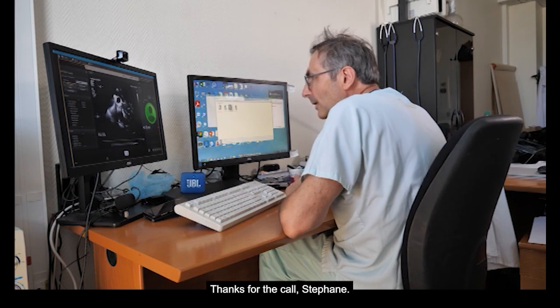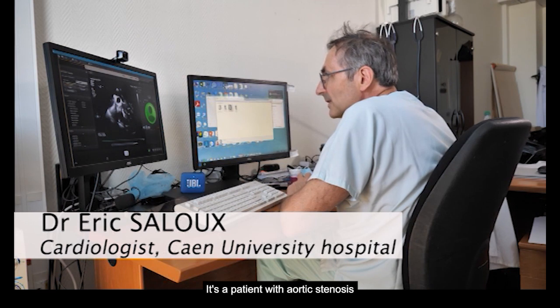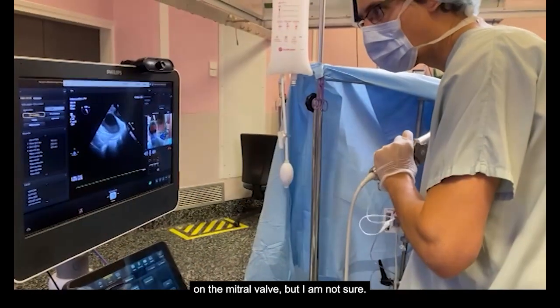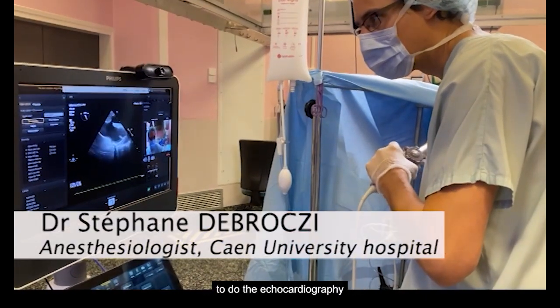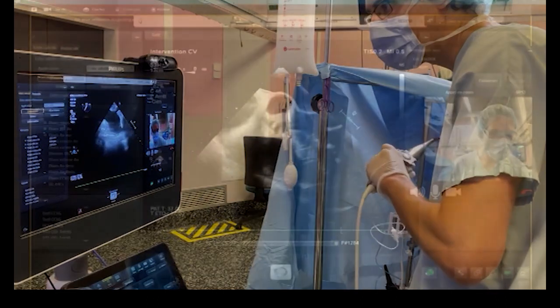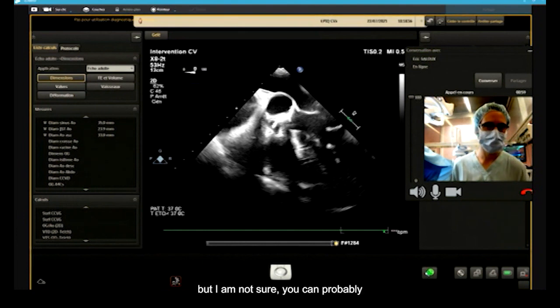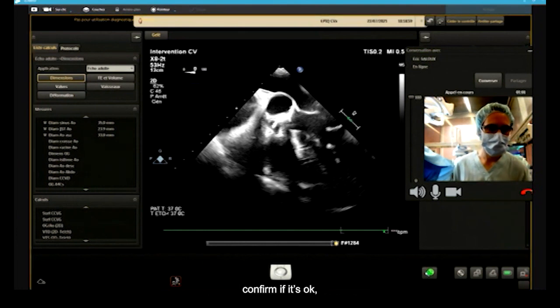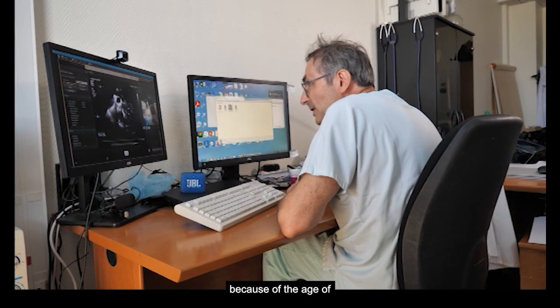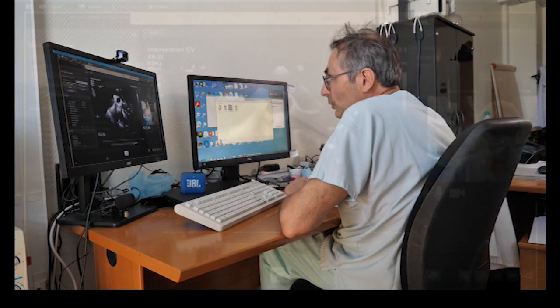Thanks for the call, Stefan. You are with a patient I saw yesterday. It's a patient with aortic stenosis and probably something on the mitral valve, but I am not sure. Because it was very difficult to do the echocardiography, the scan was very bad with a very poor echogenicity. So in my mind, there is no problem with the mitral valve, but I am not sure. You can probably confirm it's okay. And I have no idea about the mechanism of the aortic stenosis. Because of the age of the patient, it is probably a bicuspid valve, but I cannot confirm.